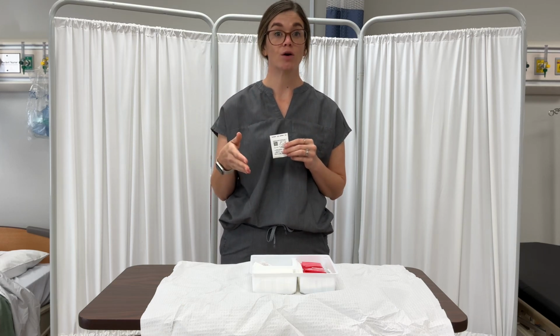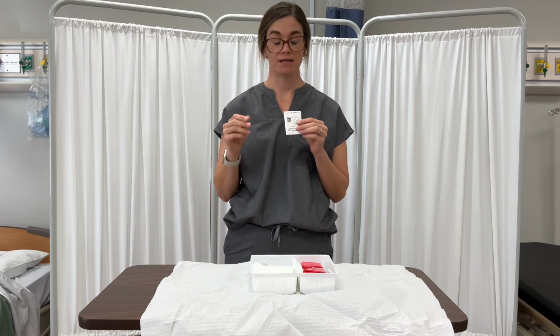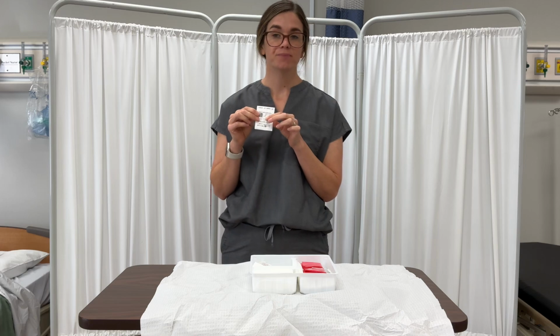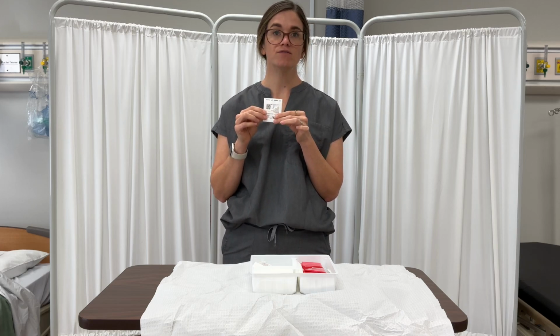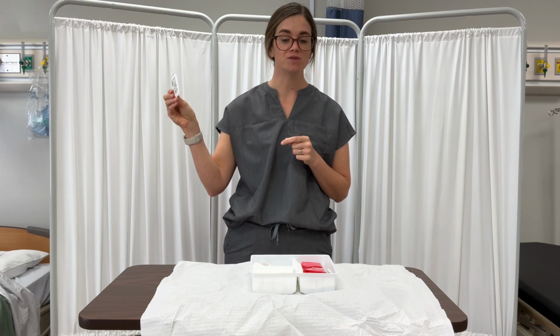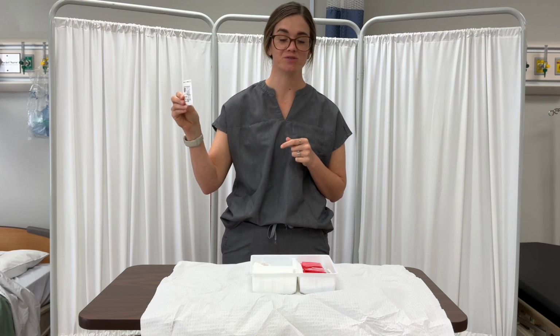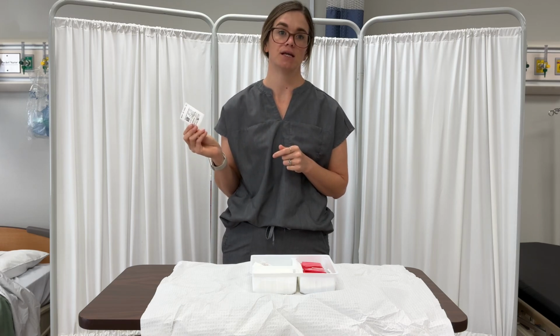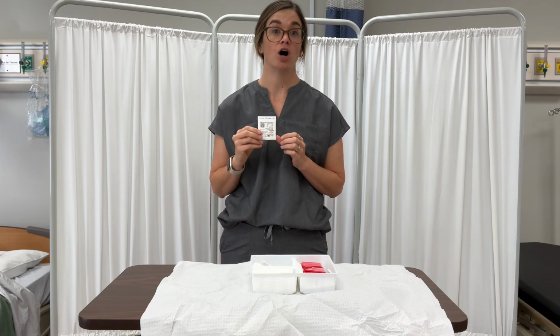So my field is already open. My hands are already clean. I have verified that my item is sterile. And previously we have talked about this being a drop-in. But again, one of our rules is to not go over our sterile field. So if you're dropping something on top of it, you're technically contaminating. So we're going to do a toss-in.